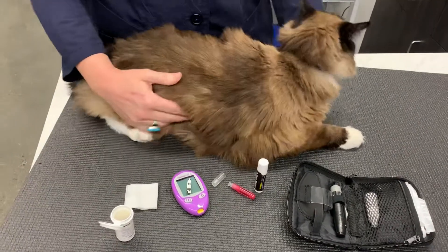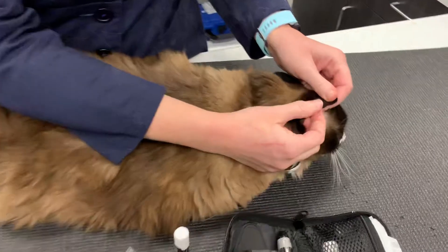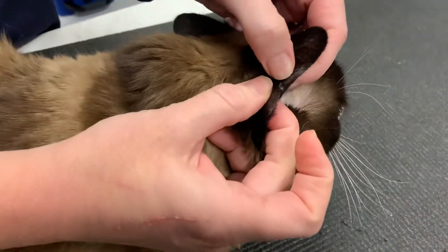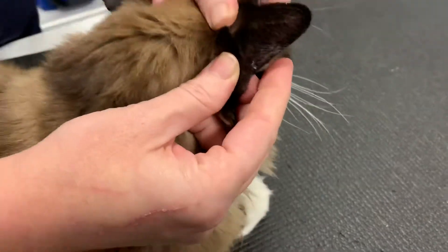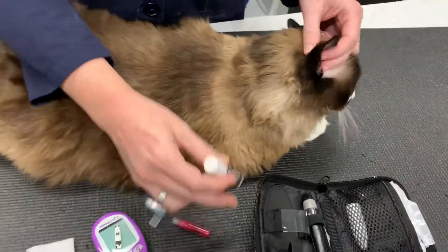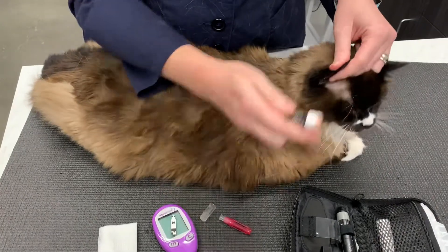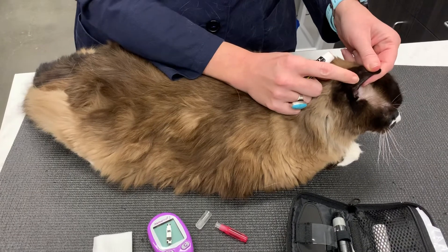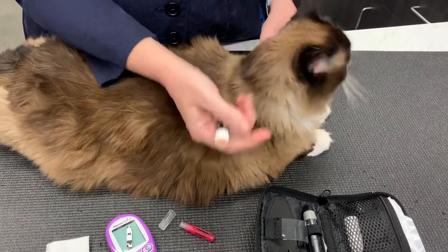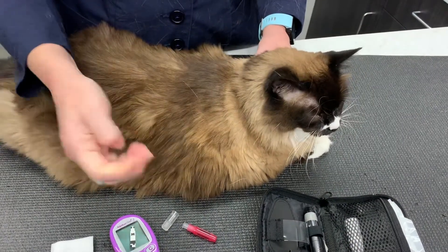The ear vein of the cat runs along the outside of the ear, really close to the edge — about two millimeters from the edge. We use old-fashioned chapstick as a little glaze on the edge of the ear so that when we poke the vein with our needle, it will make the blood bead up rather than spread out onto the fur. So it's actually very helpful.